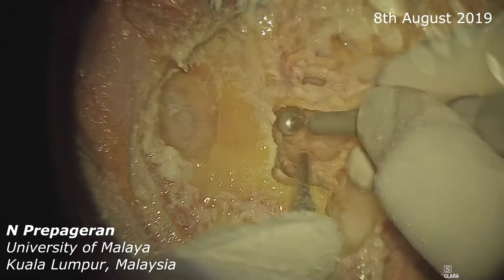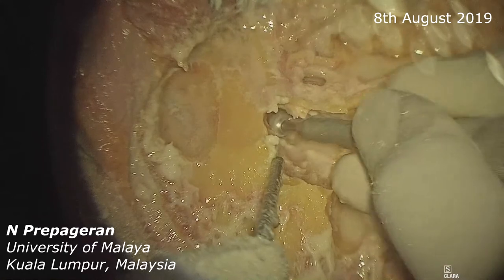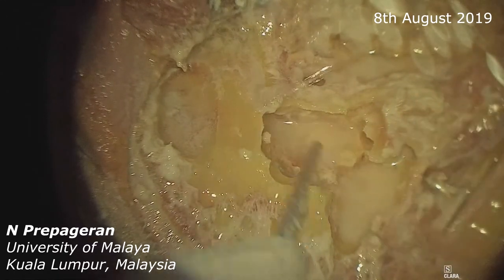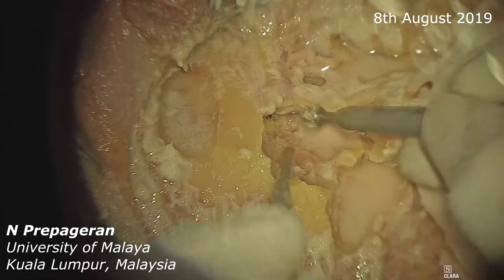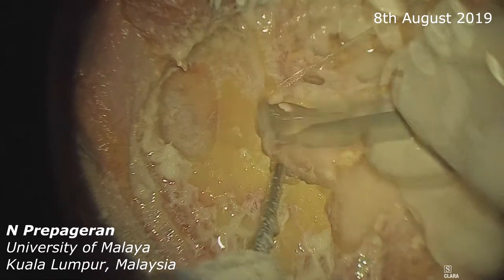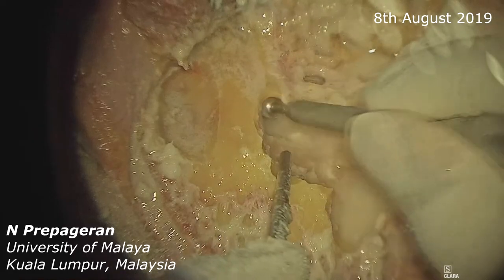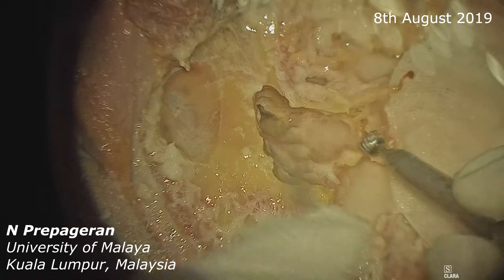Now we need to find the antrum, which should be here. Now we're coming close to the antrum. How do we know that we're in the antrum? It's when we're able to see the lateral semicircular canal. Once you find the lateral semicircular canal, we then drill the scutum, and I can see the incus coming into view.